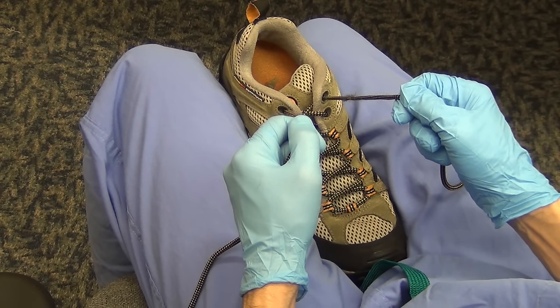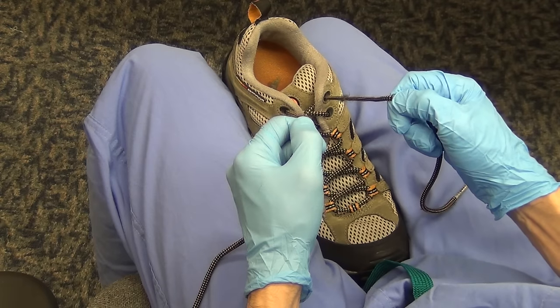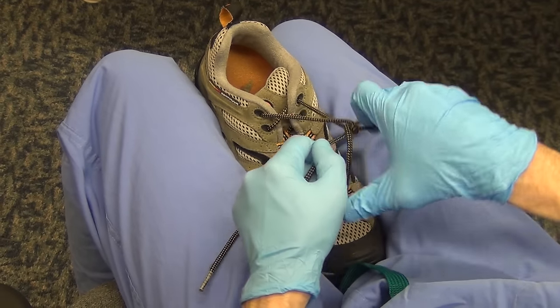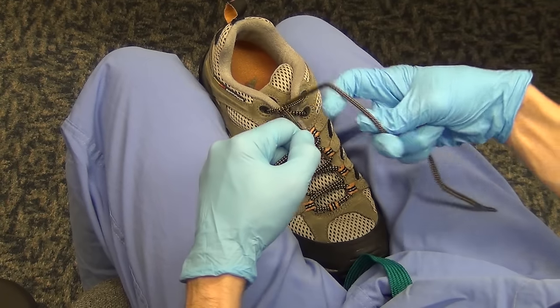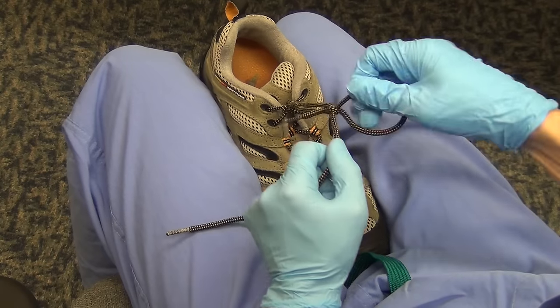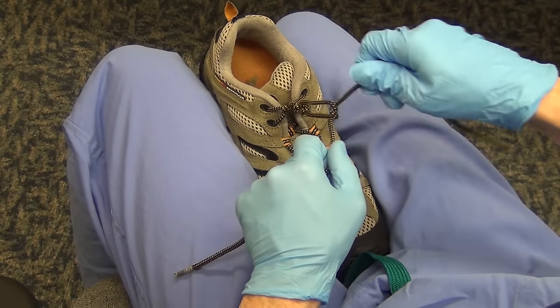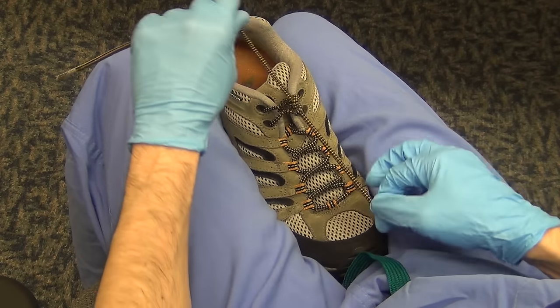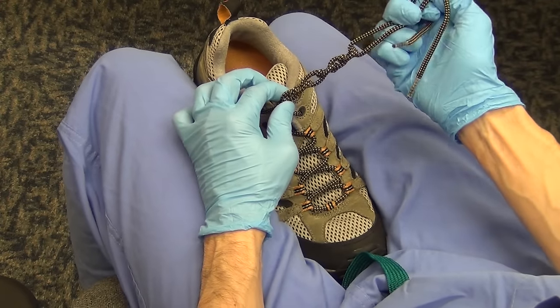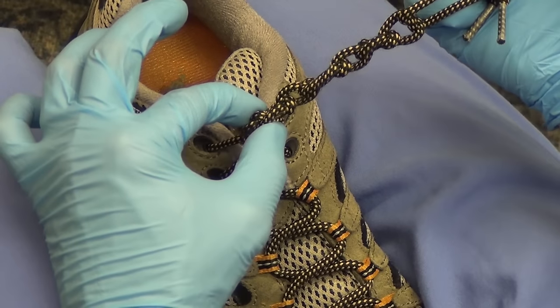Now putting it all together: alternate back and forth between the karate chop and the figure four, and just like two-handed knots, alternate when your right hand goes up and down. Karate chop, grab it, right hand goes up. Come back to figure four, pull the tail through, right hand goes down. Karate chop right hand up, figure four right hand down — and if you look at it on the shoe it looks like a little chain rope, and that's how you know these are square knots even with one-handed knots.